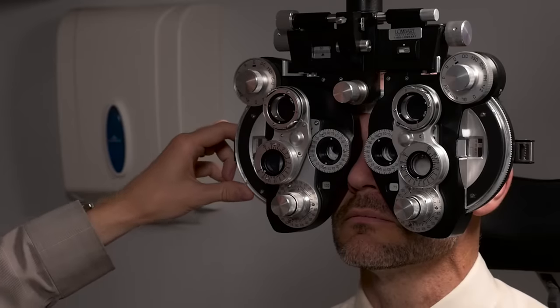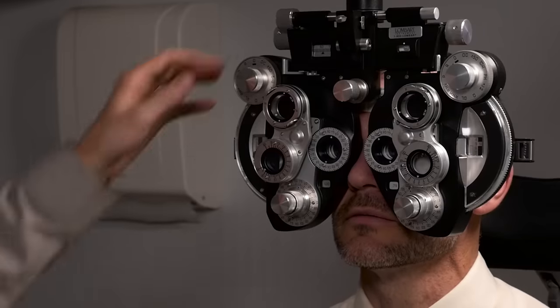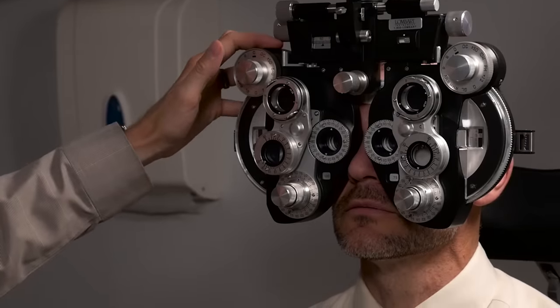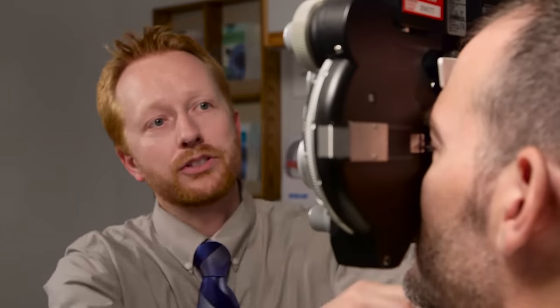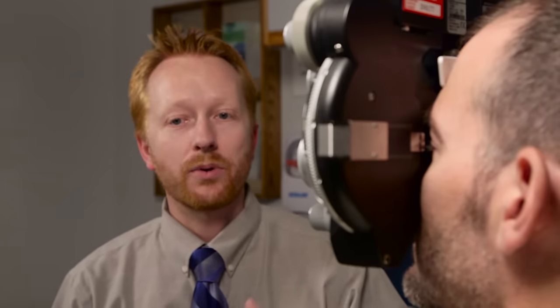So I'm going to ask him is this any better? Yes. And even better? Yes. And at this point once you get a good ballpark of the spherical component of the prescription now you switch over to do the cylinder portion of his prescription. To do so I turn this. This lens is called the JCC. The JCC is short for Jackson Cross Cylinder and it helps us refine how much astigmatism he has and what the orientation of that astigmatism is.